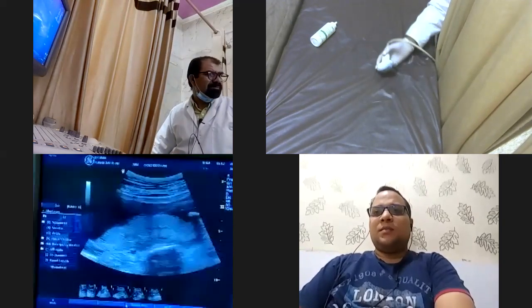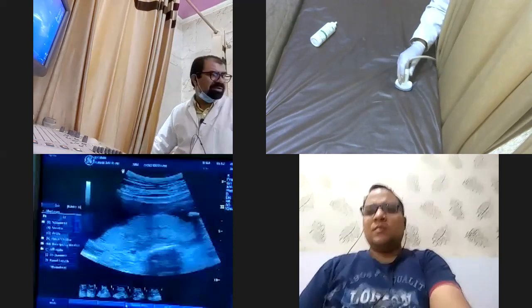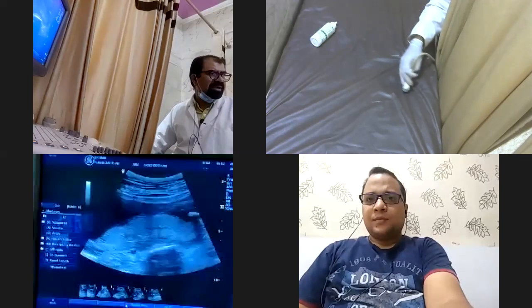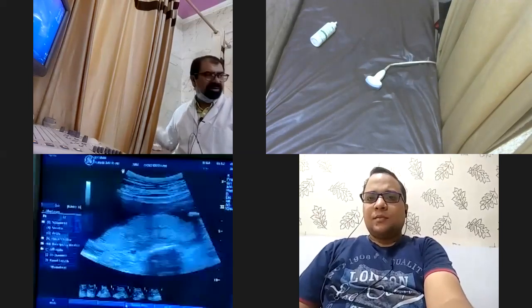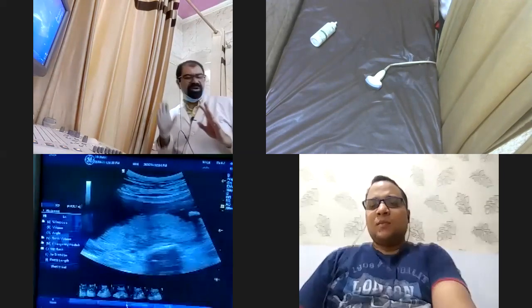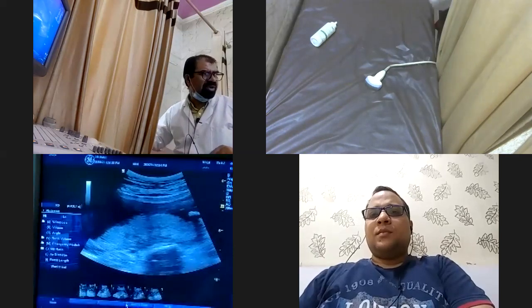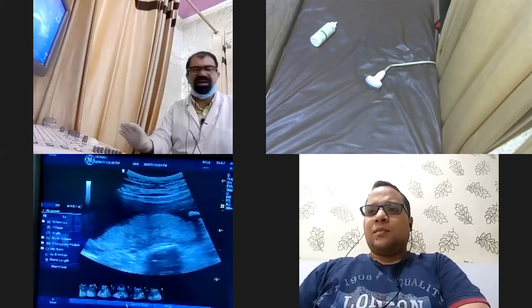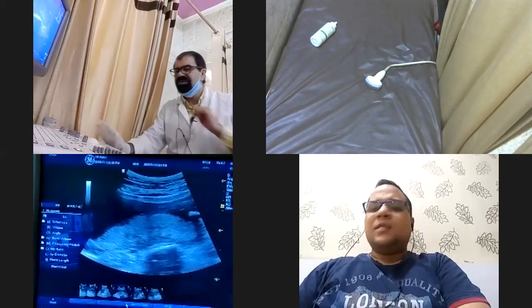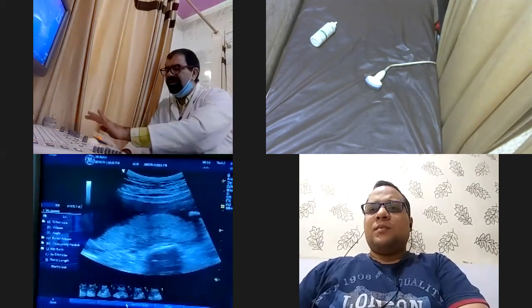Now, this is about the screen orientation and the movements of the probe. This was already sent to you in the theoretical class. We will not discuss the theoretical class over here. What we are doing is showing you the practical implementation of whatever classes we have taken with you, right? Now, tell me something about the frequency.